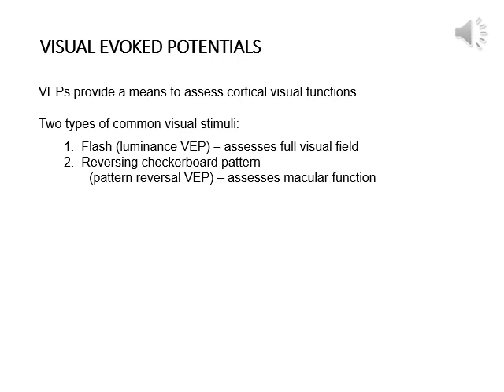However, within the clinical world, we have two standard types of stimulation, and these are chosen because normative values for these evoked potentials are well studied and well known. And so for us to use these evoked potentials, we have to stimulate in a very standardized way, and that allows us to measure against our norms.